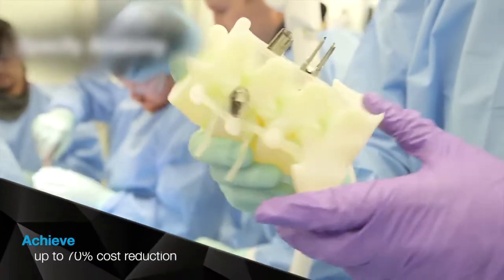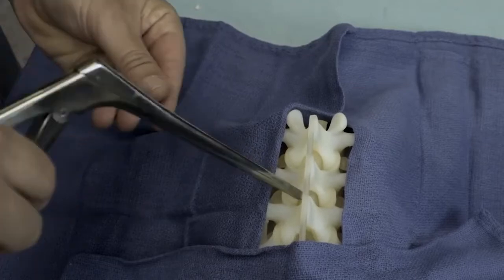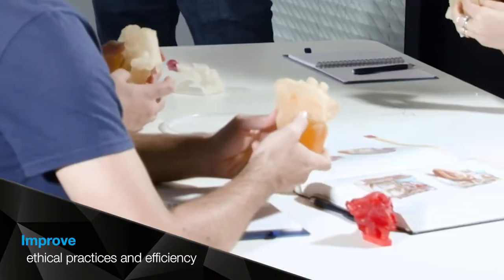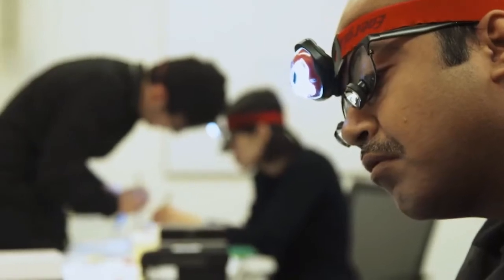Study your patient's anatomy, then plan and execute your approach before ever stepping into an operating room. Reduce the need for cadavers, clean rooms, sterilization of tools, biohazard risk, and other valuable resources.